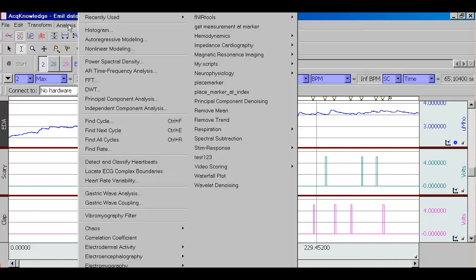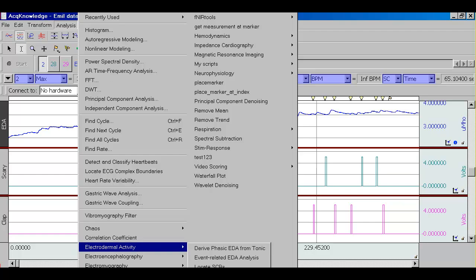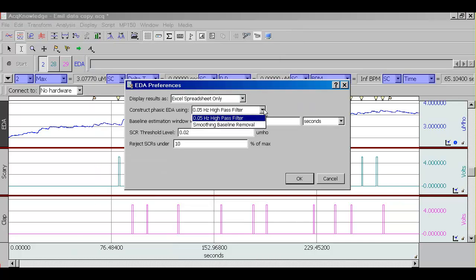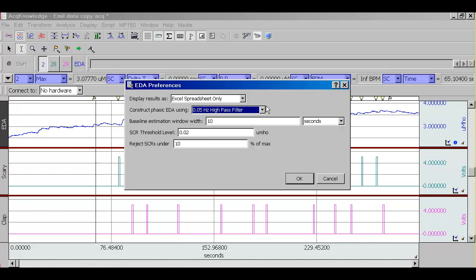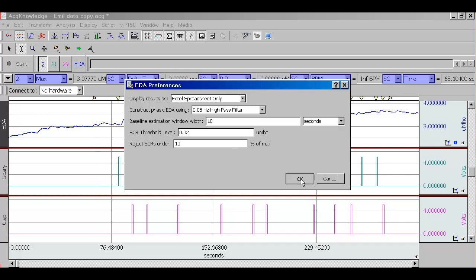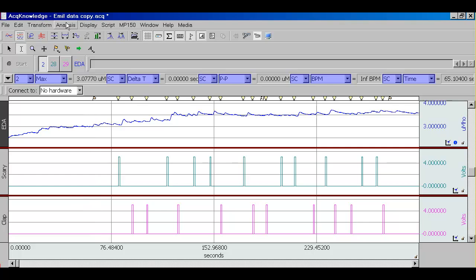At this point, we can look at the preferences for skin conductance analysis. They're found under preferences under electrodermal activity. We have two different ways of constructing the phasic electrodermal activity waveform. For right now, we'll just stick with the high-pass filter. We can specify the threshold for what will be a skin conductance response and also a rejection threshold, so only a certain percentage of the maximum skin conductance response will be accepted. All these settings will be discussed in the detailed tutorial. For right now, we'll just choose these defaults.